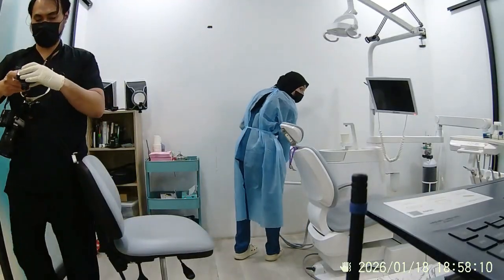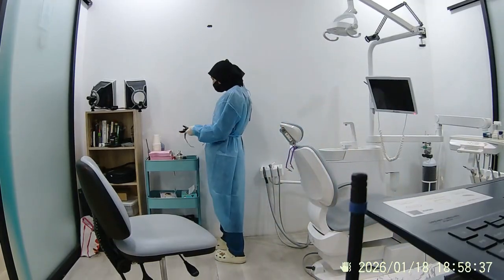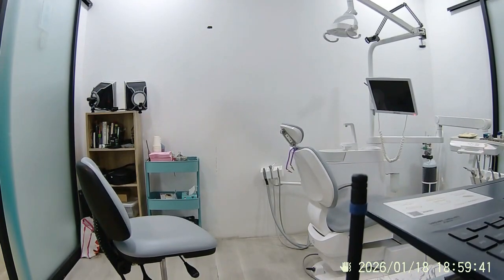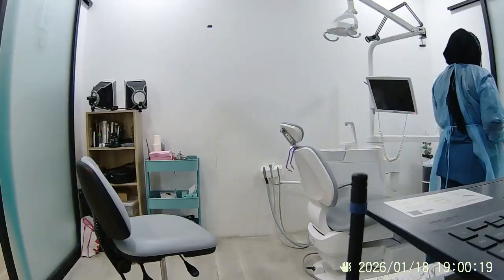If you drill down the routine, you set up the system, the lighting is very smooth, almost no friction. But of course, you need to take into account 5 to 6 minutes for the photography side in your consult. So your consult cannot be done in 15 minutes. It's just impossible. Make sure you have ample time, at least 20 to 30 minutes for a consult, because at the end of the day, we do not want to rush the consult.